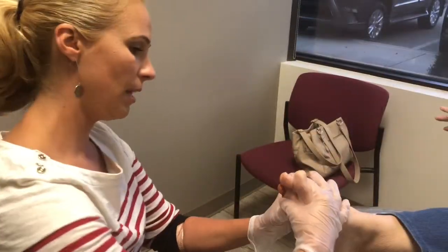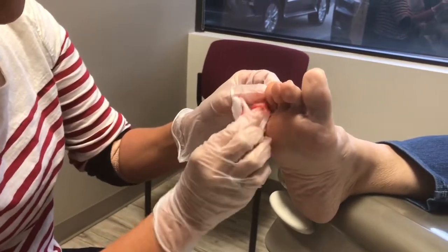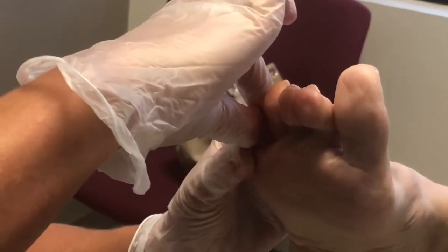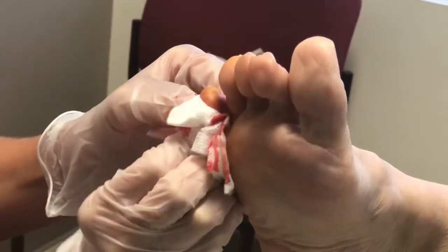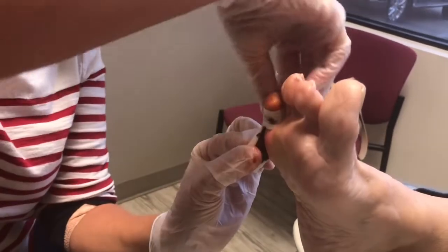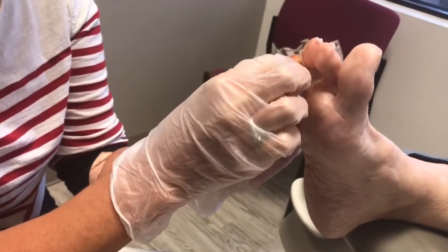I've got it down quite a bit. Just relax your foot again. Once we've released a lot of the tendon, as well as the capsule, it's really important how I bandage it, and that's why we do not remove it. What I'm going to do is pull this out and rotate it — de-rotate it this way — so when she comes back, there's a lot of scar tissue that develops and it should hopefully heal in that straight position. I'm going to take this, just some betadine, and pull it over this way, trying to get that toe to de-rotate. When this bandage dries it'll actually be firm and hard because of the betadine.